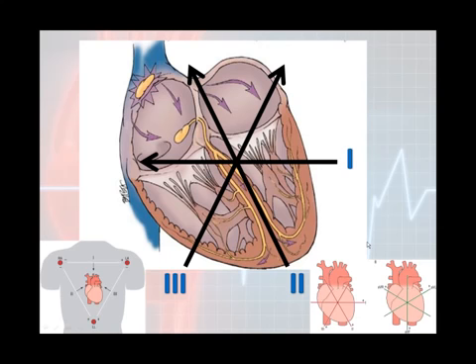Now these are the first 3 leads that were researched, leads 1, 2, and 3. But if you remember what happens now that we've actually moved this triangle into the central terminal right here. Here's our central terminal right in the middle. Now, if you remember, this is our theoretical negative down here. This is where we can actually change the camera views. So we change the camera views.